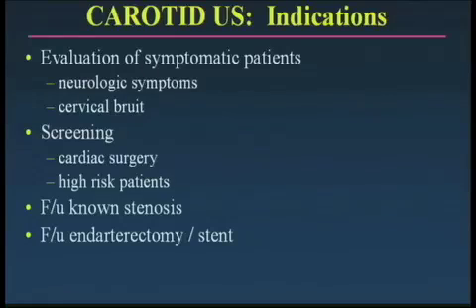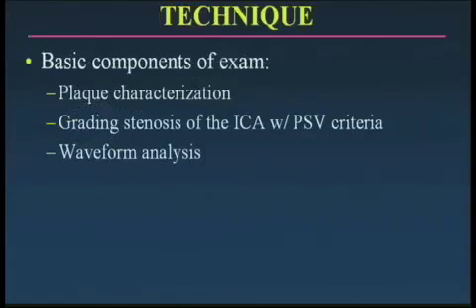We frequently do carotid ultrasound examination to follow up a known stenosis or to follow up a patient who has undergone carotid endarterectomy or carotid stent placement. Well, what is the technique of the examination?